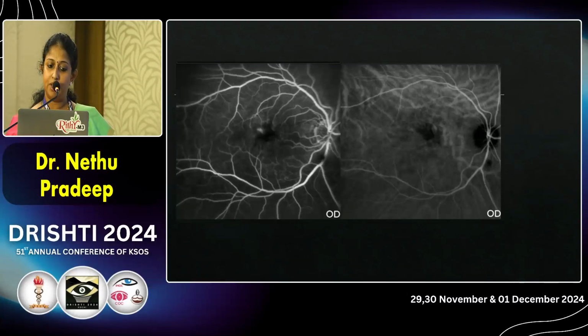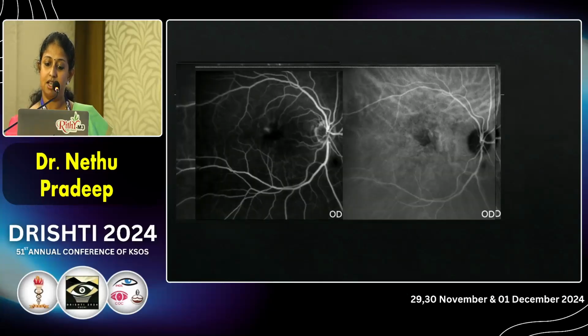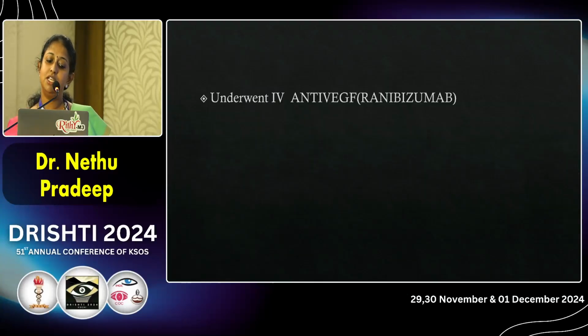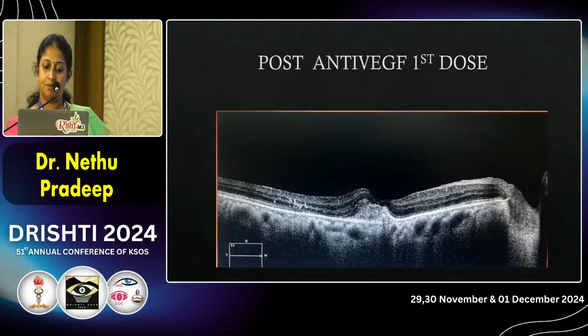This patient also underwent an FFA ICG. So here also we can see a hyperfluorescent spot or a hotspot at the termination of a retinal vessel, and there is late leakage. The patient underwent intravitreal injection of ranibizumab.